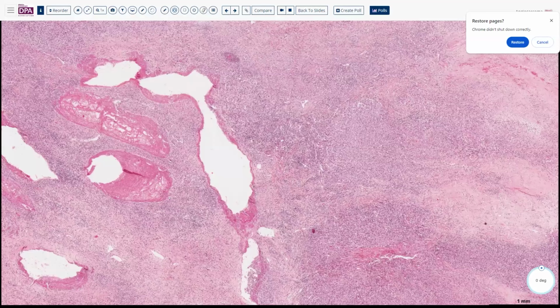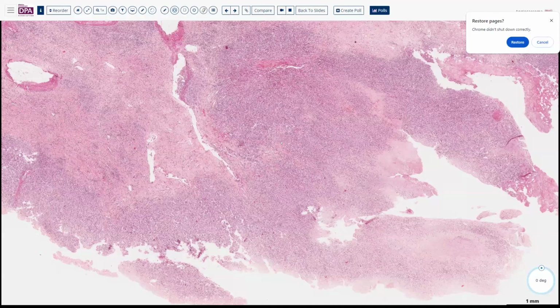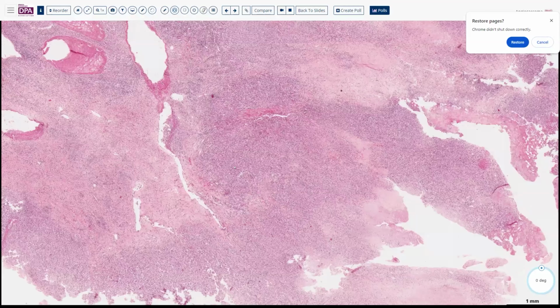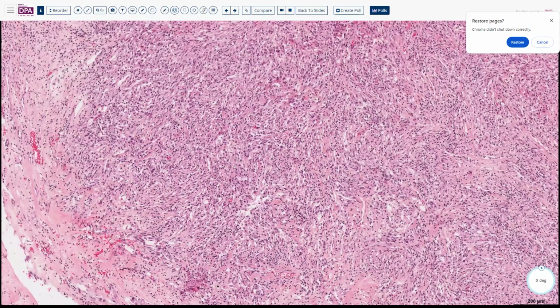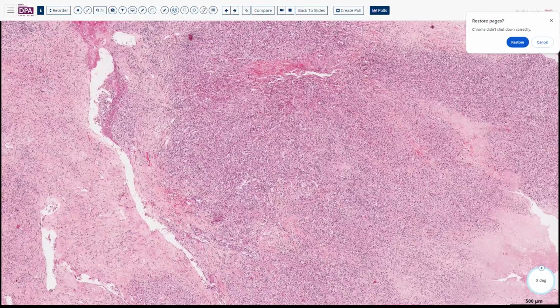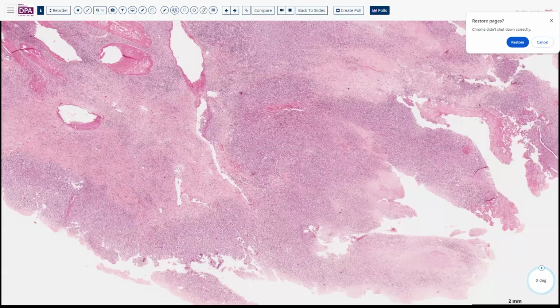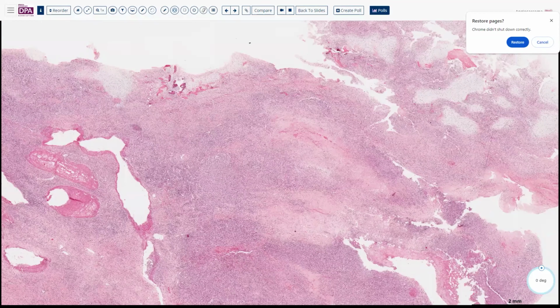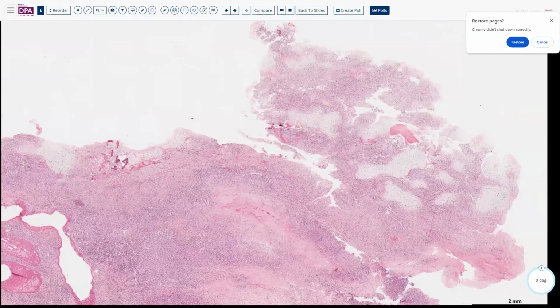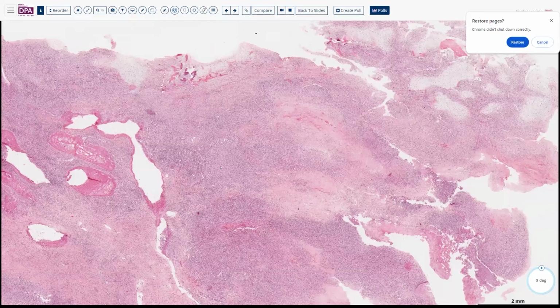More recently, these tumors have been identified to have an MDM2 mutation, which, as you may know, has an interesting correlate with intraosseous type low-grade osteosarcomas. So it's possible that this is the same driver mutation, and that may be part of what's driving this kind of low-grade chondroid or osteochondroid proliferation over here.